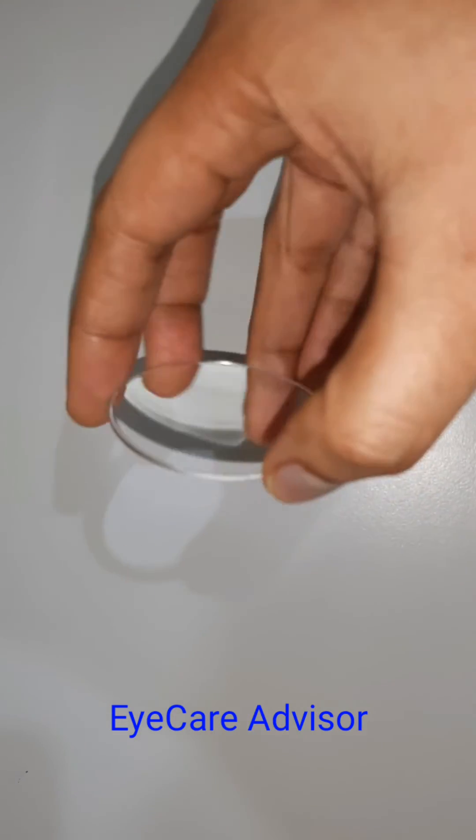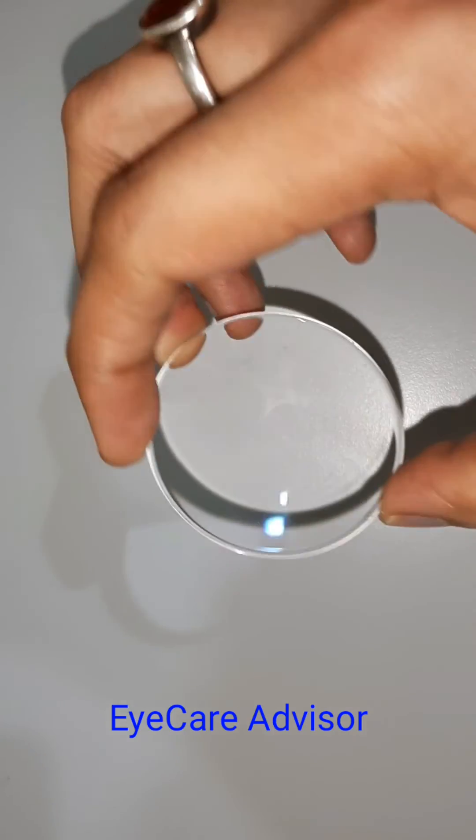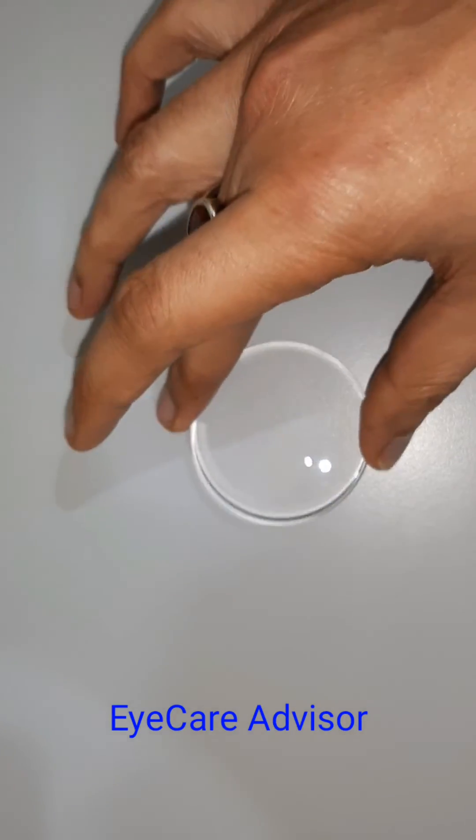The prescription of these glasses is plus 2.50 with minus 2 cylindrical. You can see the thickness is very small — very thin — and the lens size is also very small.